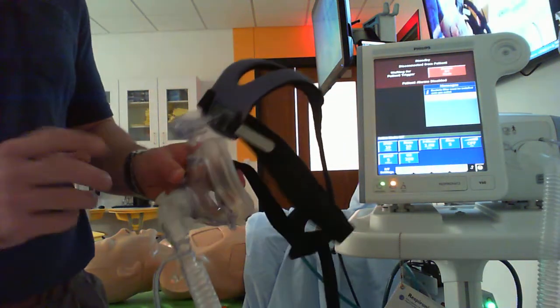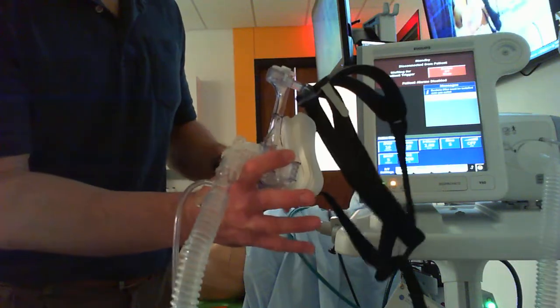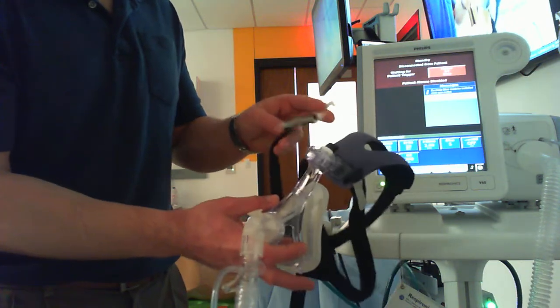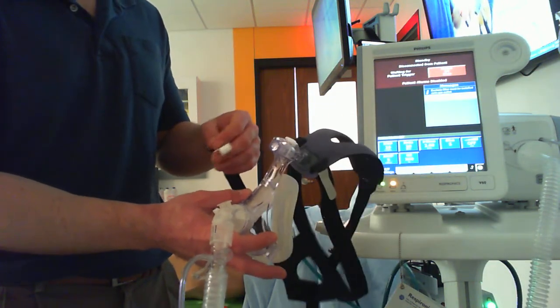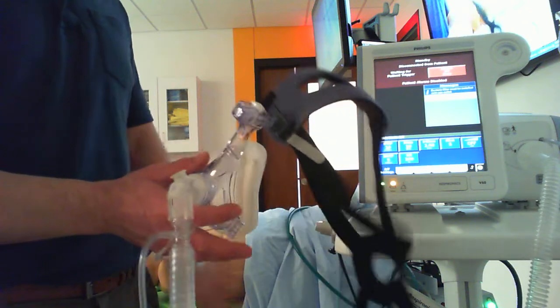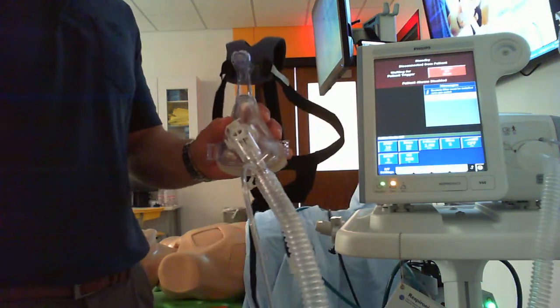But what you're going to find yourself doing is a lot of different things one-handed, and it's far easier to hold the mask on one-handed and make one-handed changes with tightening straps than it is to loosen them. Just my clinical experience there. All right, so I like to get these straps nice and loose, make sure I got the appropriate mask.